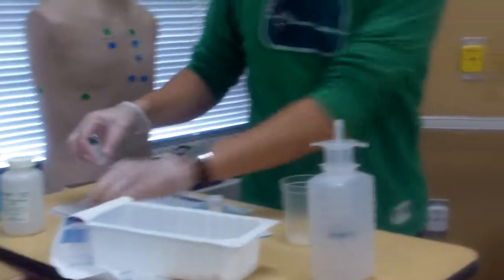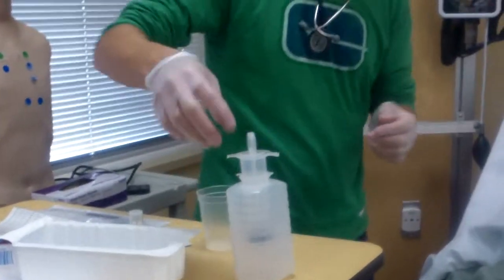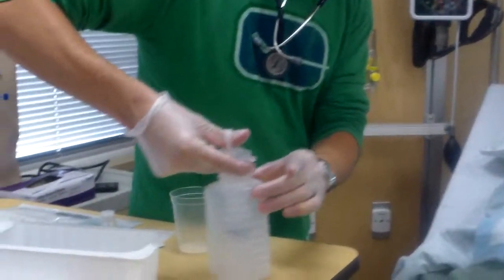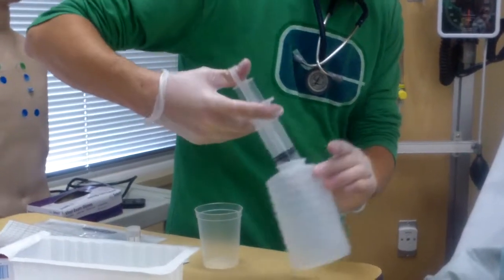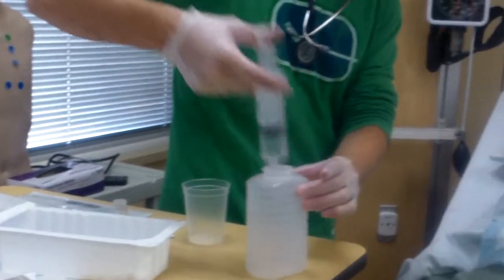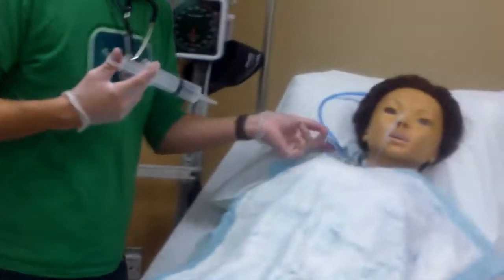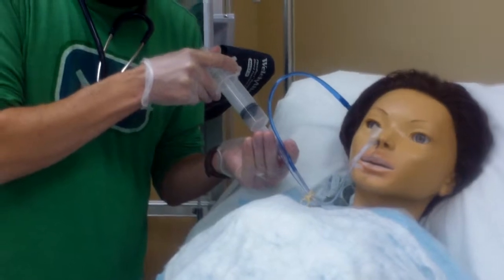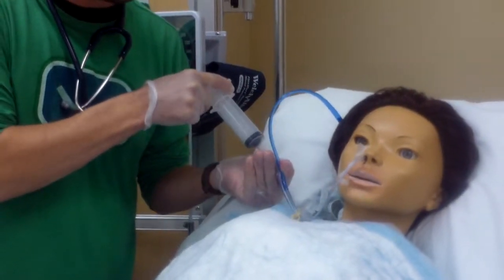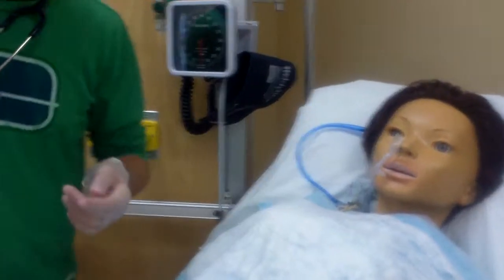Alright, now I need to flush this once again. Since I'm flushing, it's not in between. In between I would be using 10 ml. So I'm going to flush with another 30. So my 30. Okay, we're going to do that. Flushing the rest of the medication down with some water. Okay, so that's good.